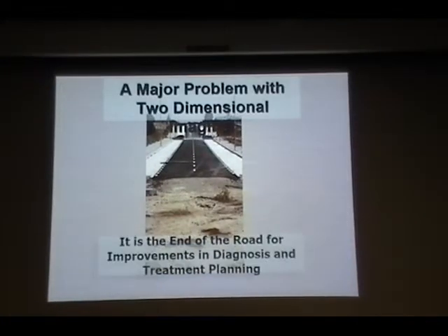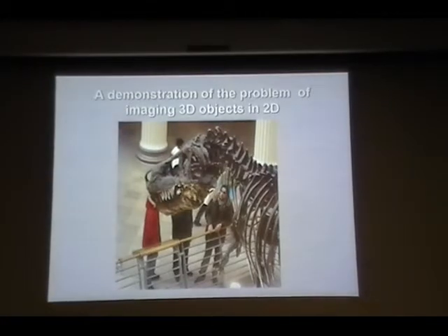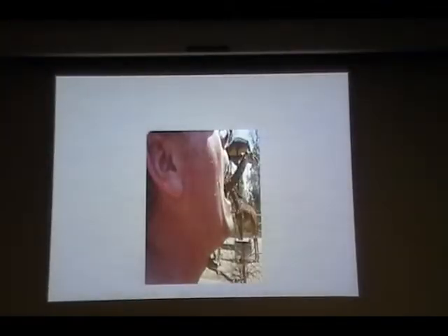So what was the problem with 2D imaging? There will be some superimposition. Like we taught in the panoramic radiograph, because of the projection geometry, there will be some superimposition happening. For instance, like this one, which I think you may have seen, and this one, right? So it's hard for us to tell if there is superimposition, especially when we are dealing with a diagnostic process.